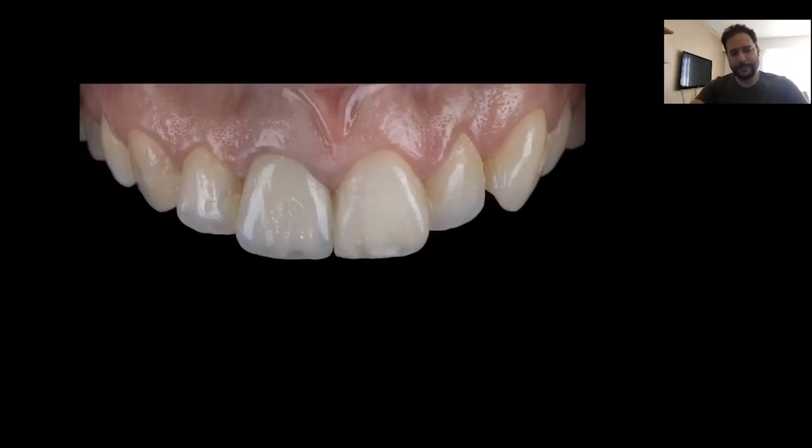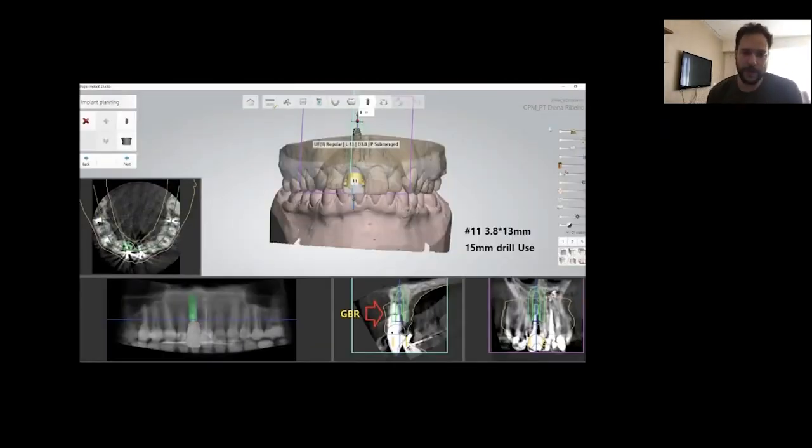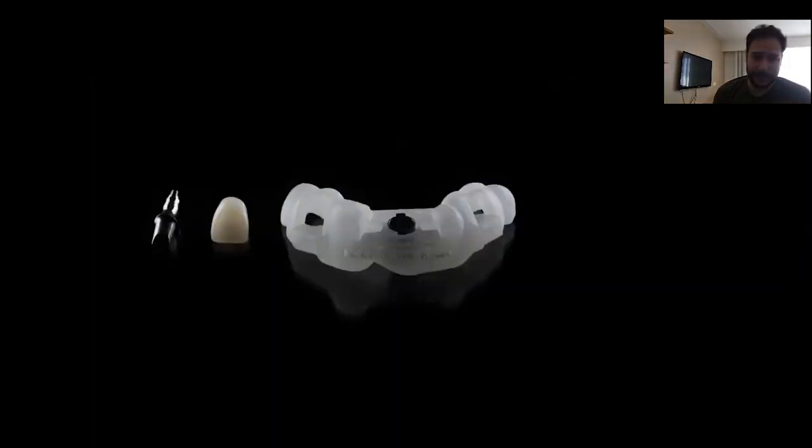Let's see some examples. This is a clinical case of a central incisor — tooth 11, it is fractured; the root is fractured. So we are going to place an immediate implant in the aesthetic area for a young lady who is very demanding aesthetically.